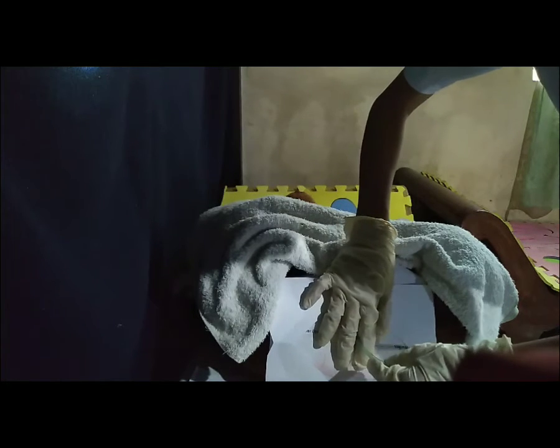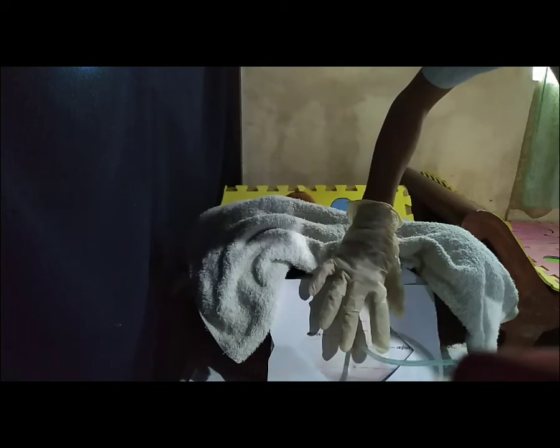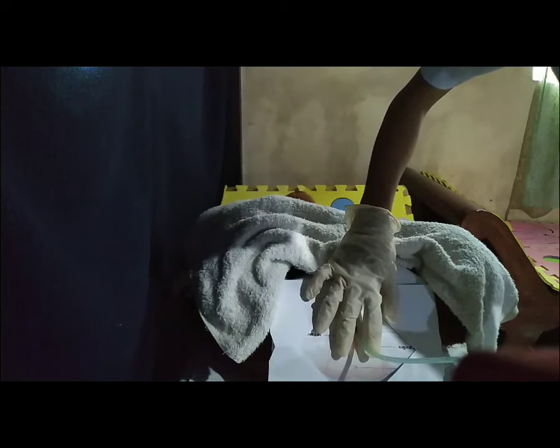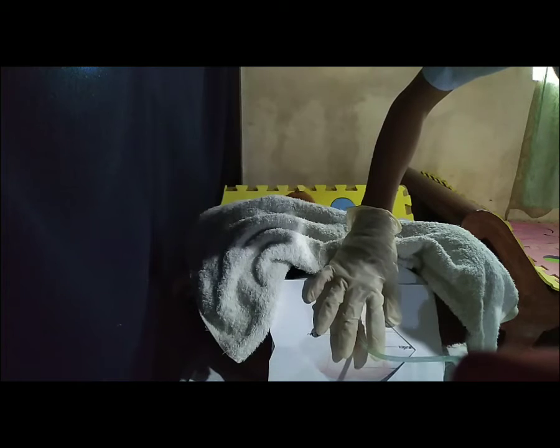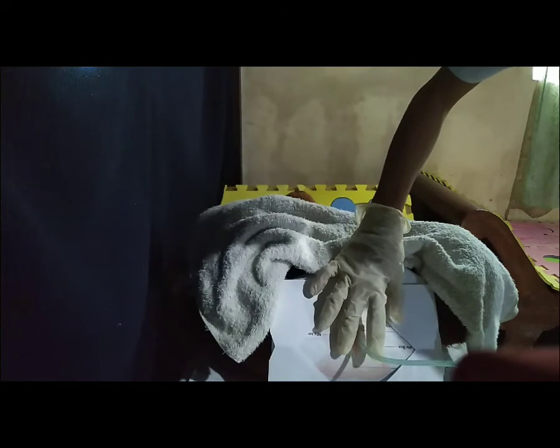After inserting around 3 to 4 inches and you have observed the urine flow, that's the time that we will advance further around 1 to 2 inches to properly anchor the balloon.